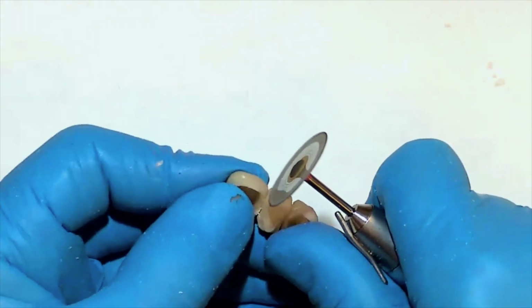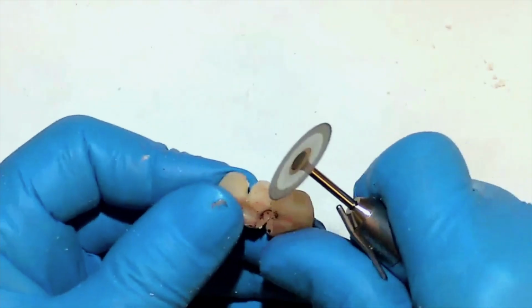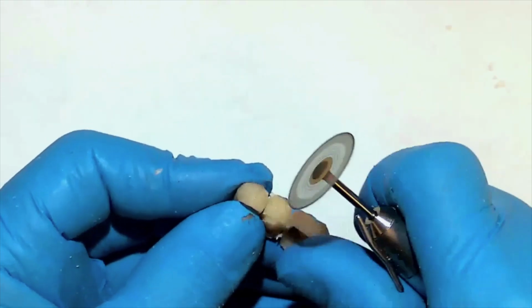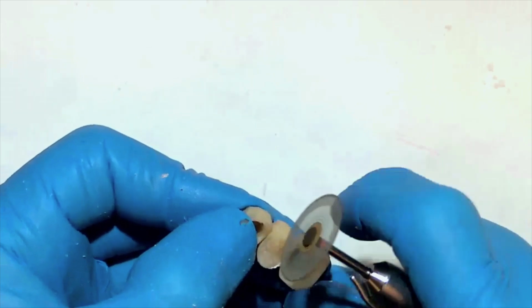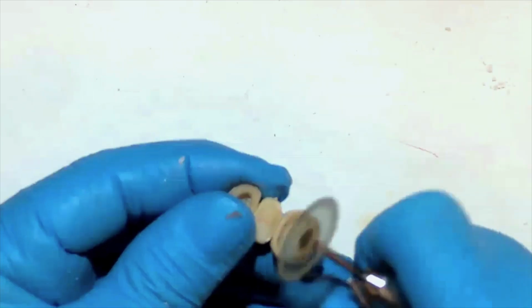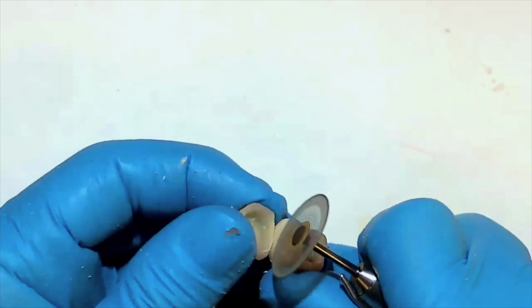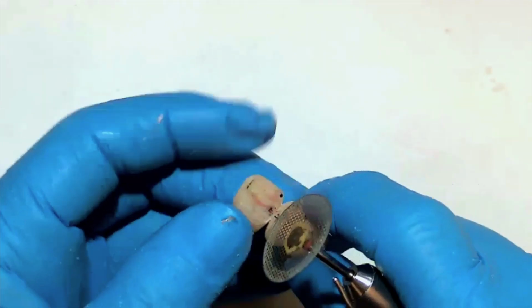Now we're going to refine the embrasures a little more. Use the wheel to give good contour to the embrasures. Giving a little contour to the pontic.